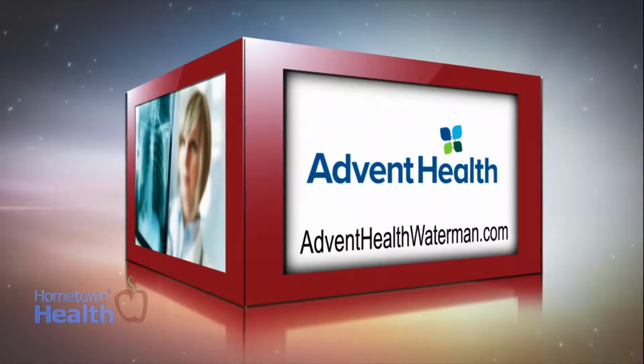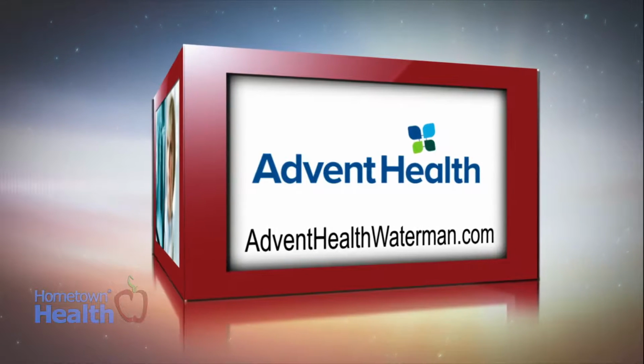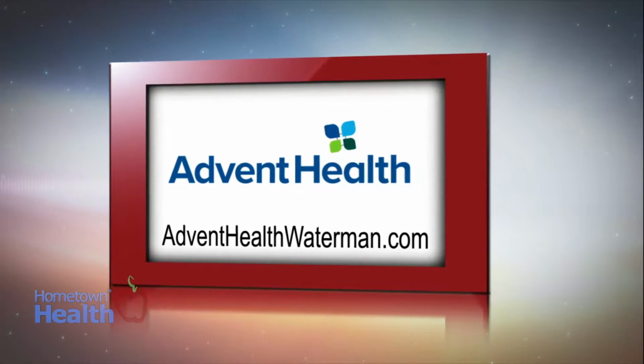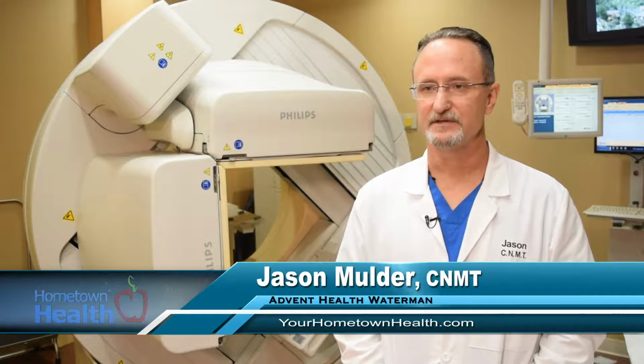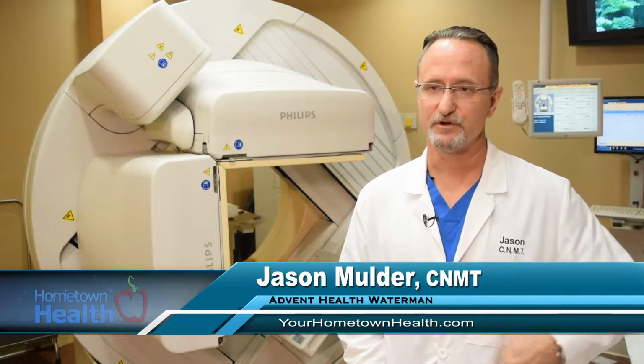We spoke with Jason Mulder, Supervisor of Nuclear Imaging at AdventHealth Waterman, to get a better understanding of how their advanced imaging technology can help patients get to the bottom of their endocrine issues. Imaging is used here at the hospital to detect endocrine issues using ultrasound and using nuclear medicine. Those are the two main tests that we normally use.